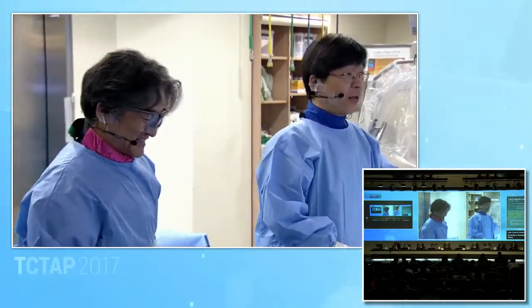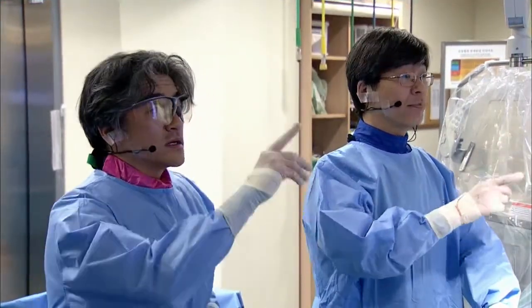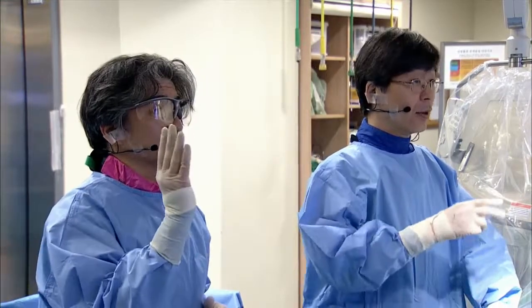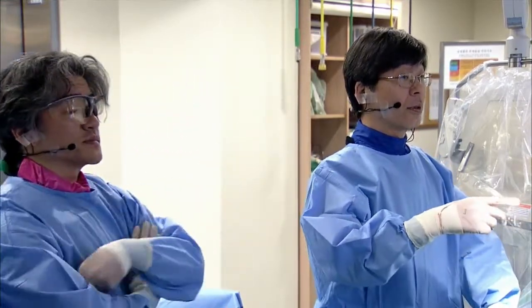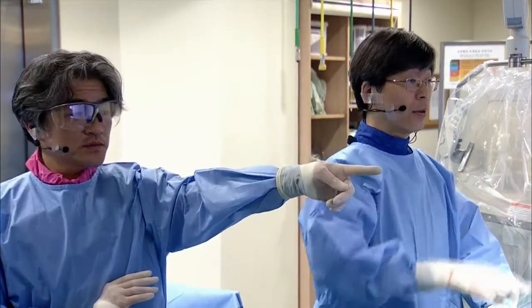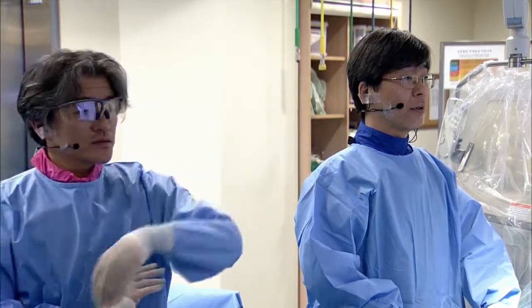Okay, go ahead. Show me the first slide. Okay. Next. Please show the angio, the one taken with the fluoro. The angio, please show where the angio started.